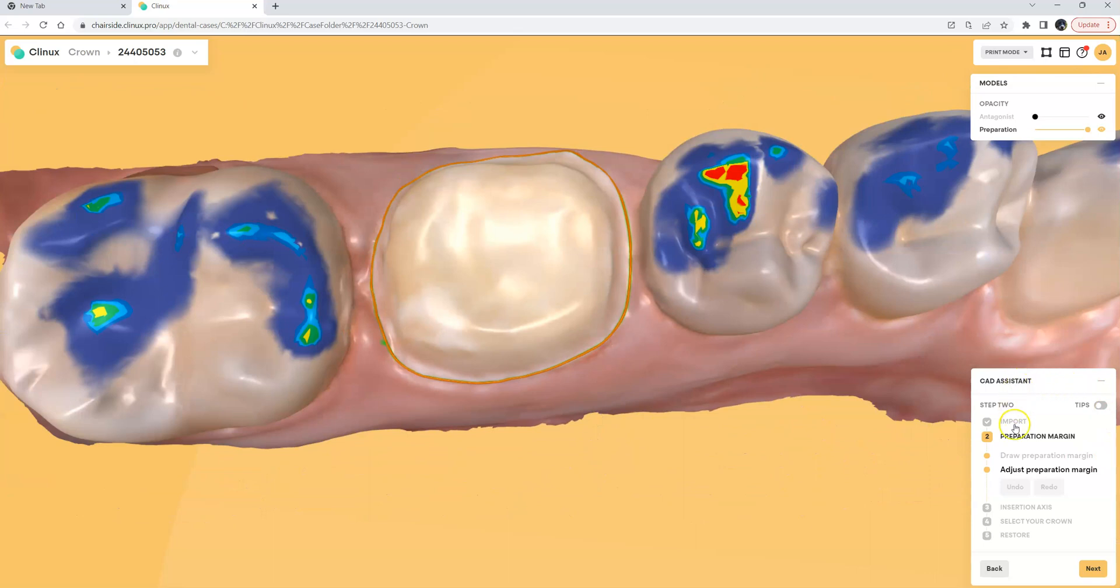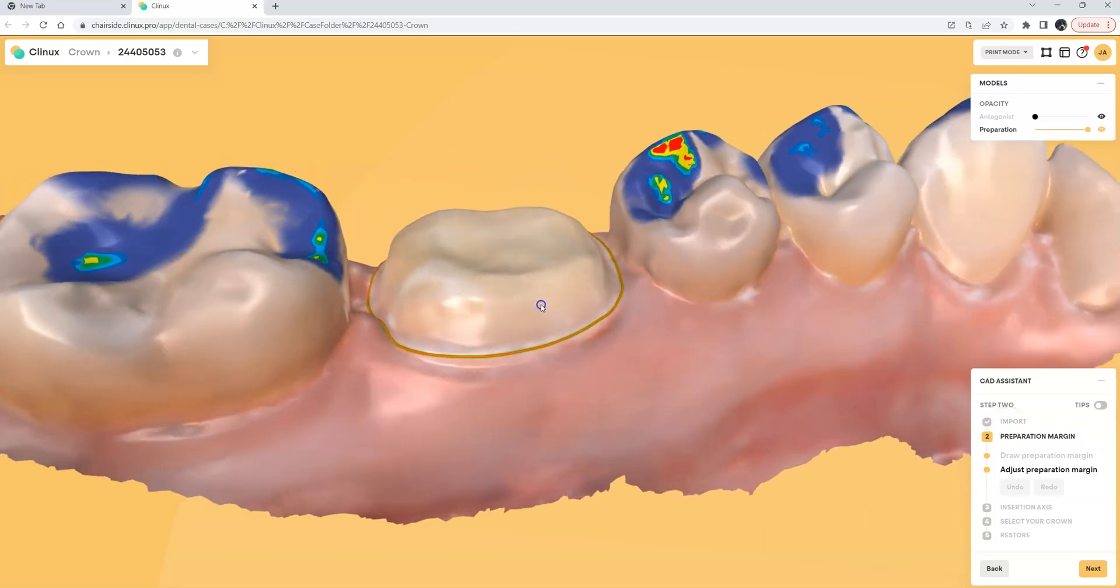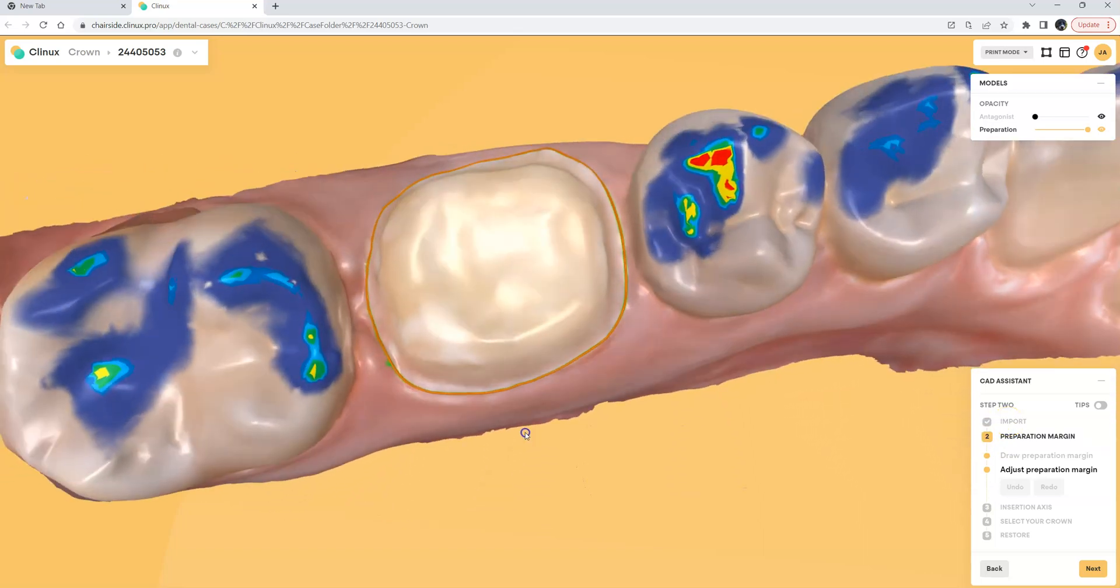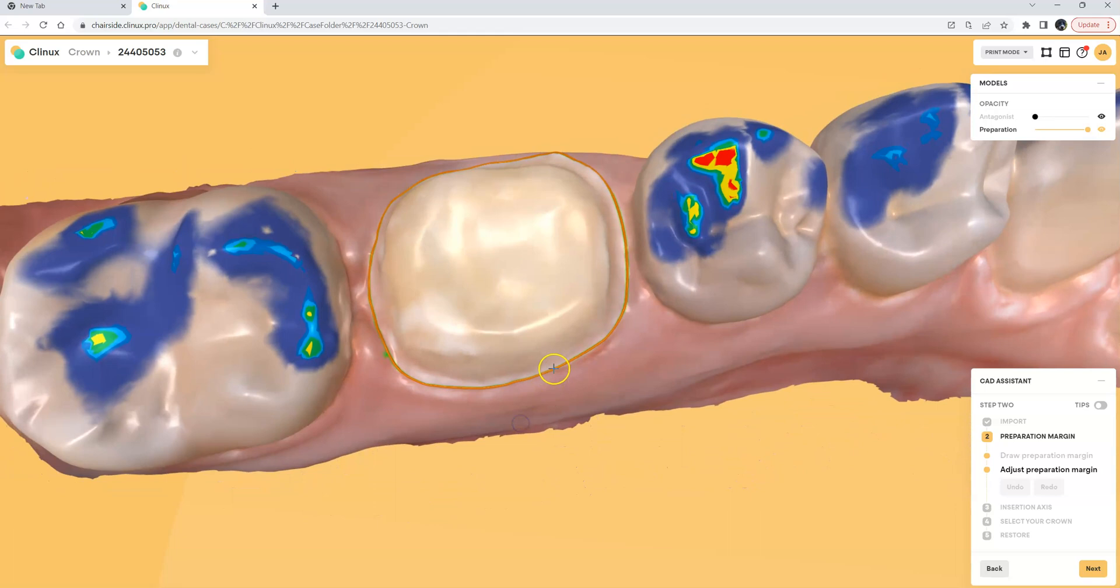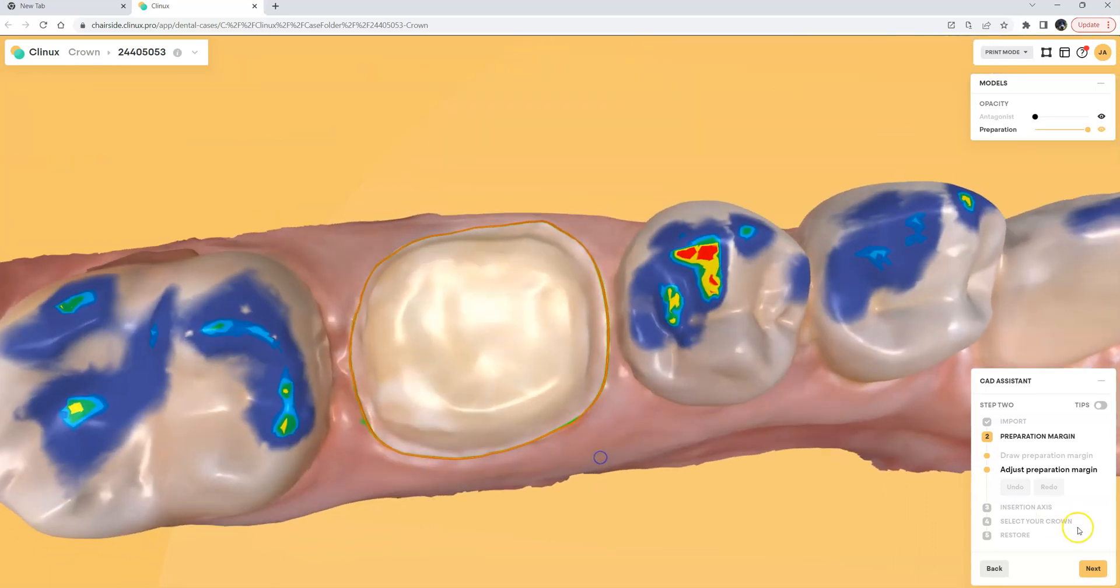So if you follow the CAD assistant down in the lower right hand corner, the first step which is already complete automatically is called import. The second step is draw the prep margin. You can see we drew that in MeditLink but if I wanted to edit it I can just give it a double-click and I can reconnect it to itself by double-clicking to make any changes but the margin line does look pretty good.